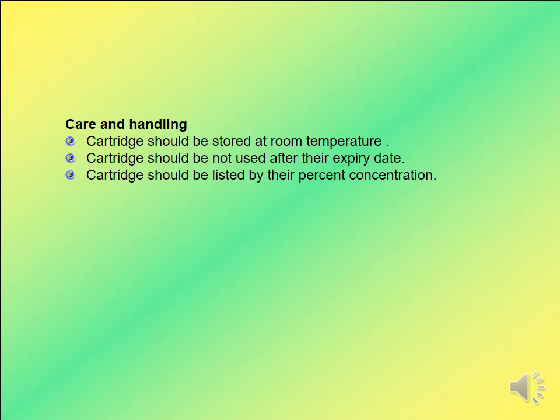Care and handling of cartridge. Cartridge should be stored at room temperature. Cartridge should not be used after their expiry date. Cartridge should be listed by their percent concentration.